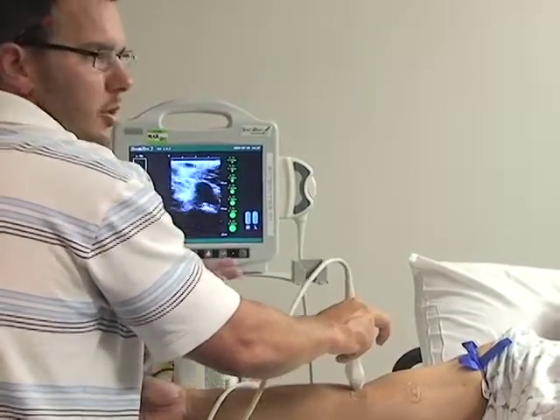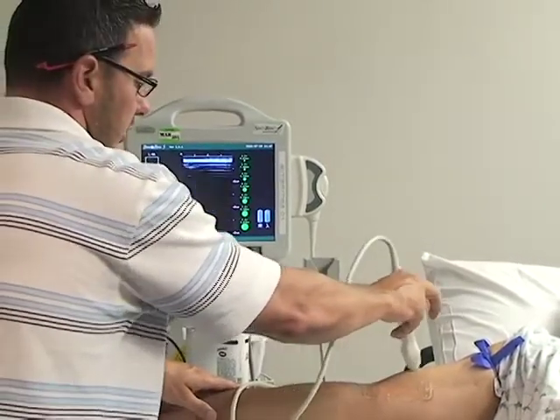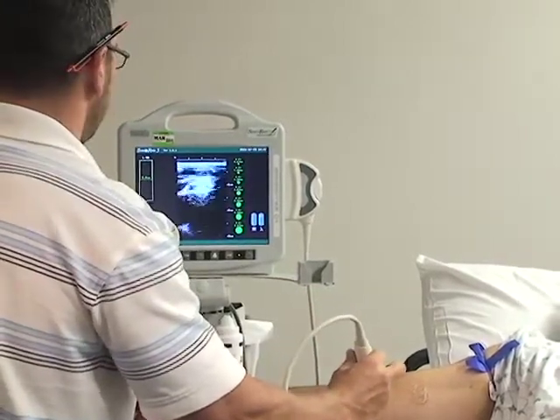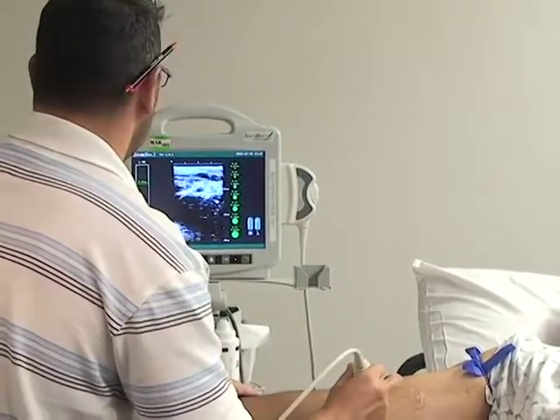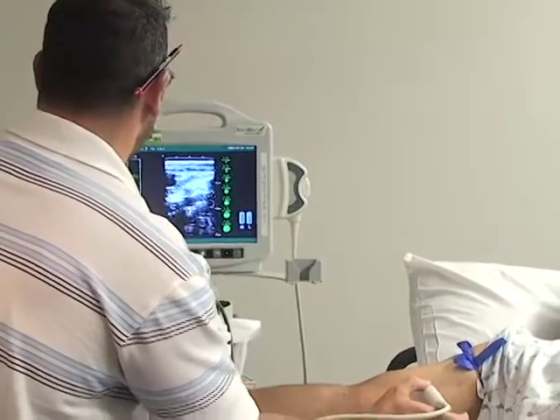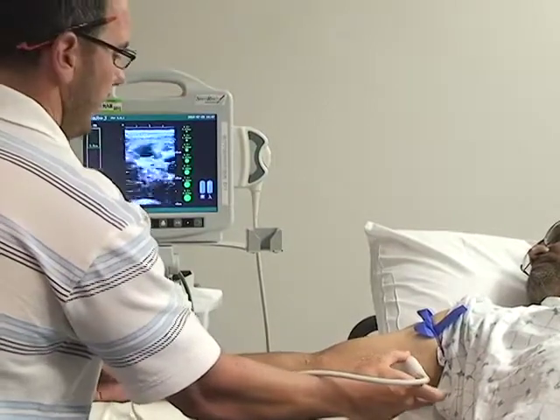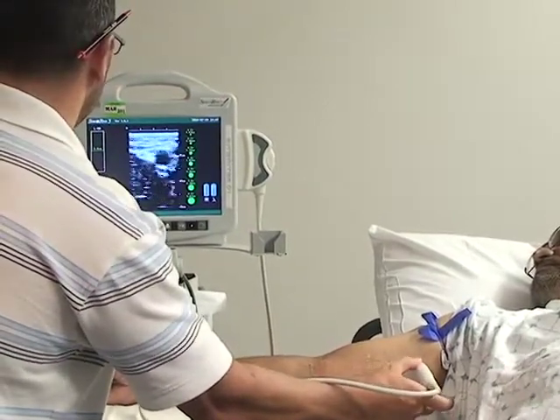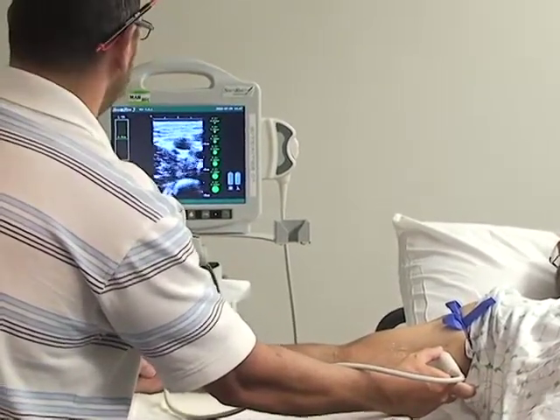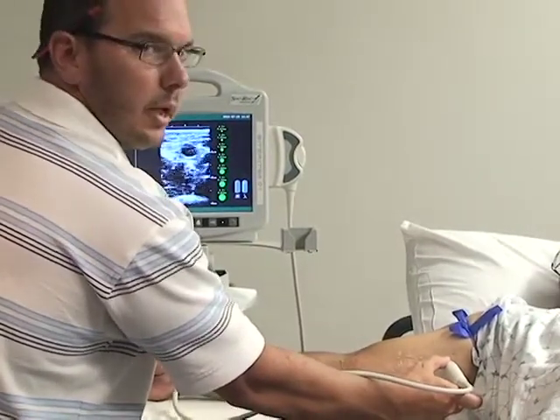So you identify in the middle of the arm, by landmarks, you know, as a nurse or whatever, the cephalic vein, and you can follow it up. You can see it even going away with the arm. You go over here and you have the brachial complex, which is where the brachial artery and nerve run. As you go up the arm, you can identify the brachial complex again, and if you drop down here, the big vein that's off by itself away from the rest of the brachial complex is the basilic vein. And as you can see, it's a giant vein, which is perfect for a PICC line insertion.